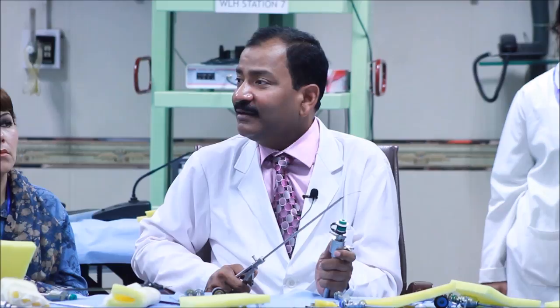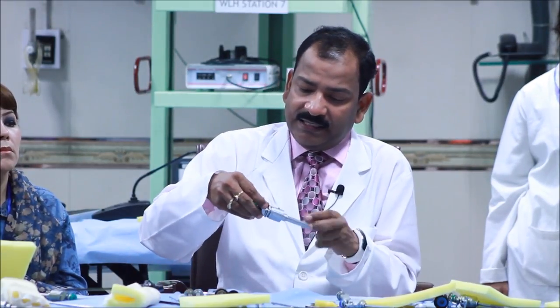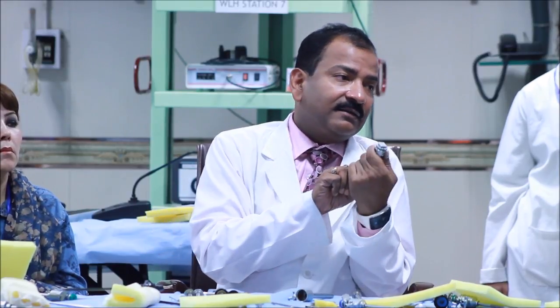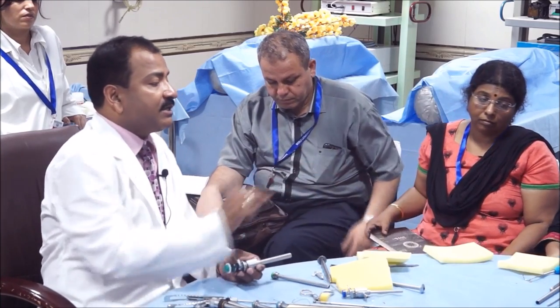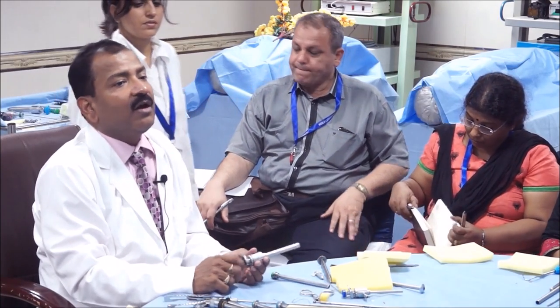Always keep in mind that if you do not use the long reducer and try directly taking it into the cannula, it can break from here. And if you see here, it is in the valve. See, it is trapped in the valve here, and it is a little lost. So this is not good. Always use a long reducer for the needle, for suturing, knotting. These are knot pushers: Van Dargaard knot pusher, Clark knot pusher. So for suturing, knotting, use a long reducer.